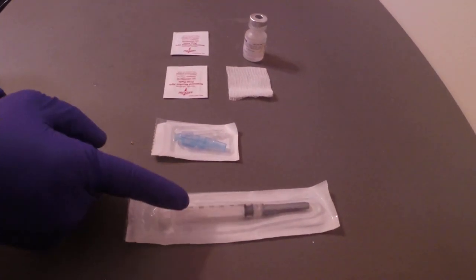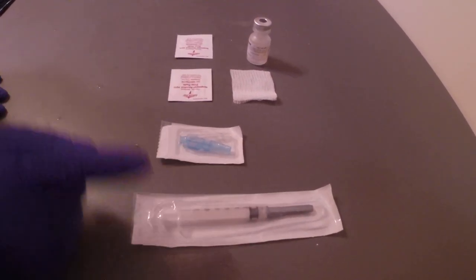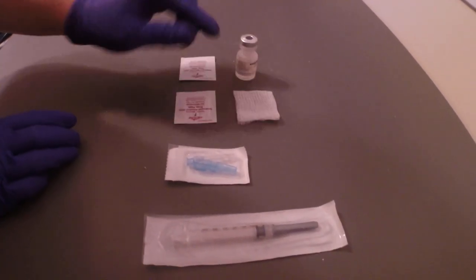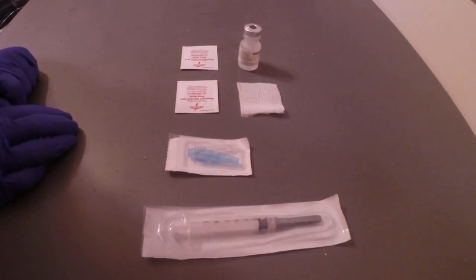So we have the items that we need here: a syringe, needle, a couple alcohol preps, our simulated medication will be glucagon 1 ml, and a gauze should we need it for any mild bleeding.